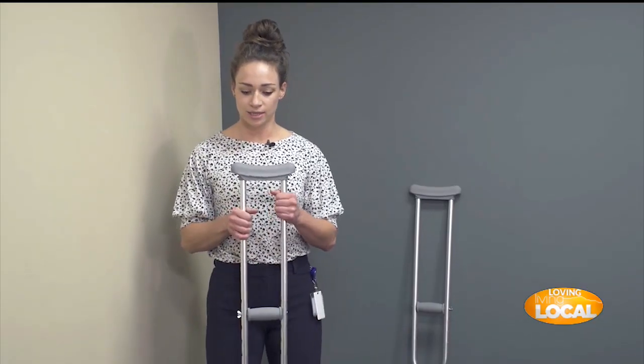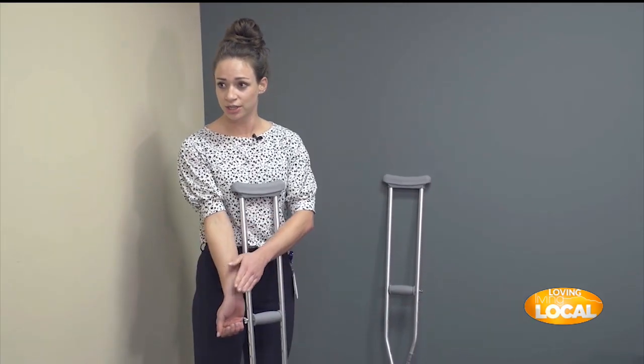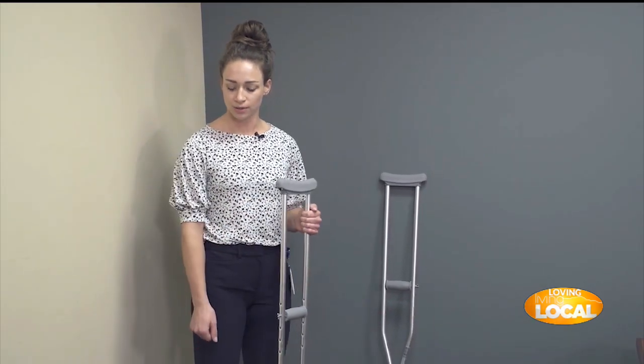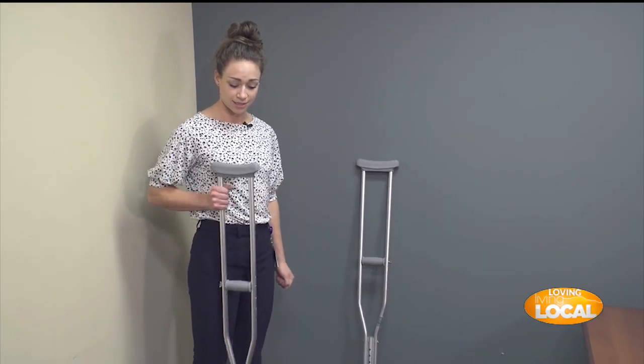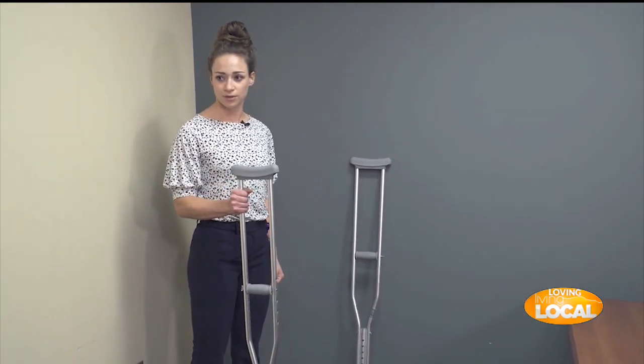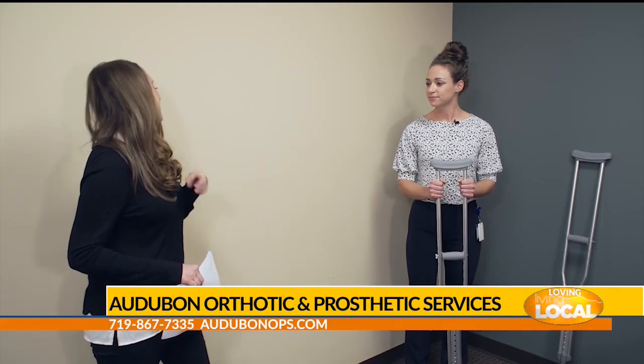For canes, hold your hand down to the side — the top of the cane should hit your wrist. The same general principle applies to walkers, but positioned a little higher with a slight bend in the elbow. Also make sure the device is a little bit in front of you — not too far back and not too far forward.